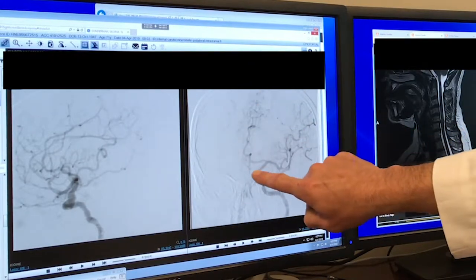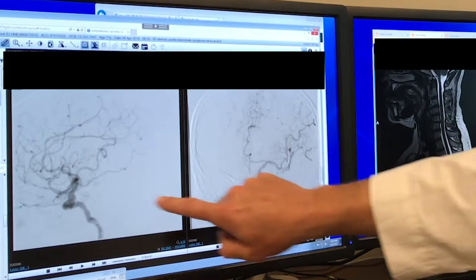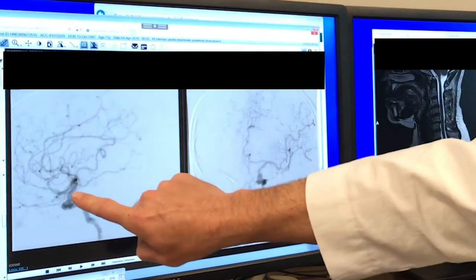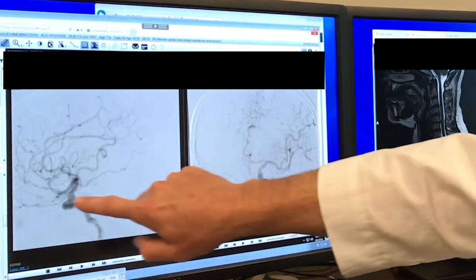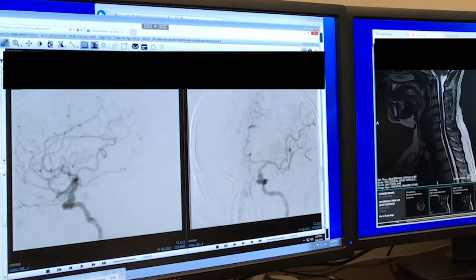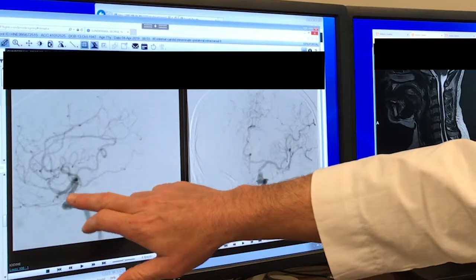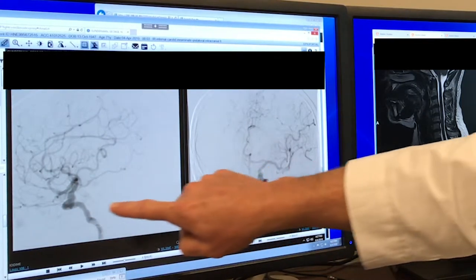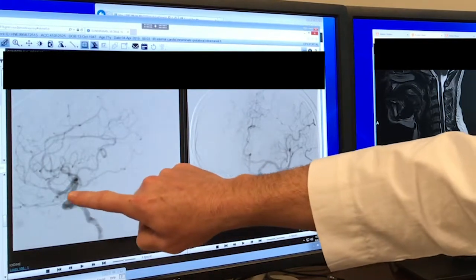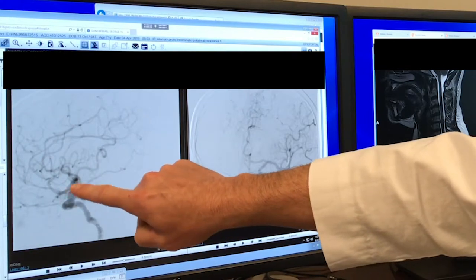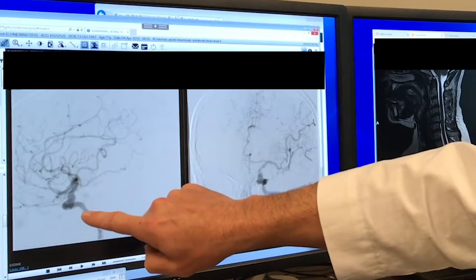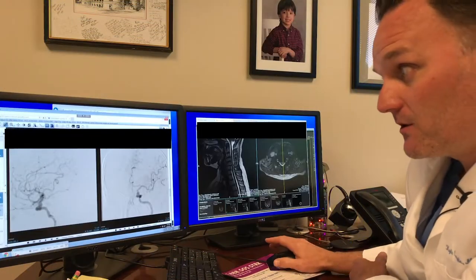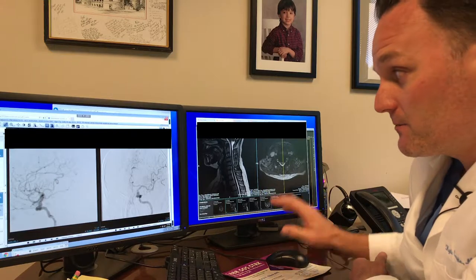This is the brain filling, but right here we have this abnormality — right here from the front and right here from the side. That abnormality is an aneurysm, and that aneurysm is the one we're going to fix by placing a special stent, which is essentially a metal mesh tube inside of the artery to reconstruct the artery. This particular stent is called a pipeline and it's specially made to fix arteries in this location.